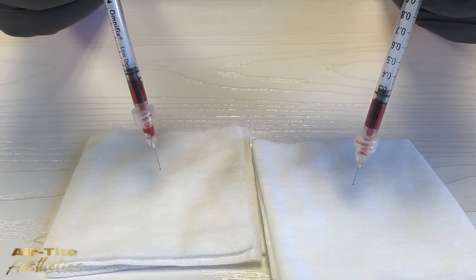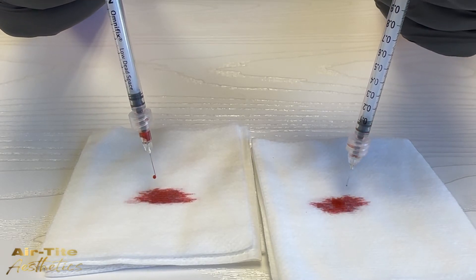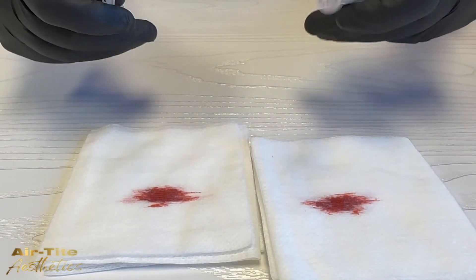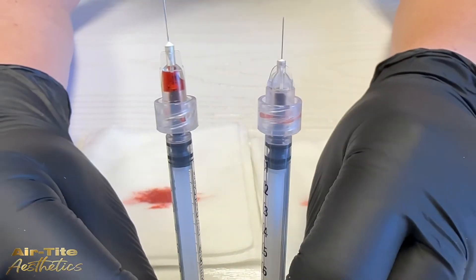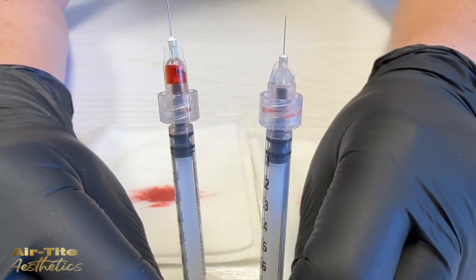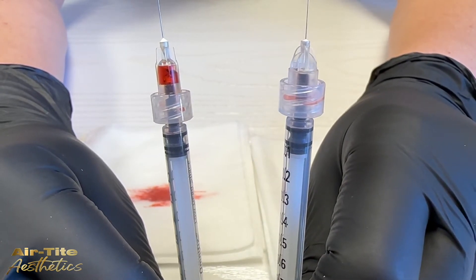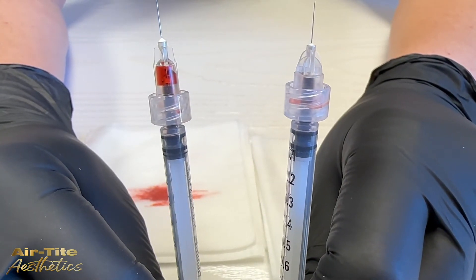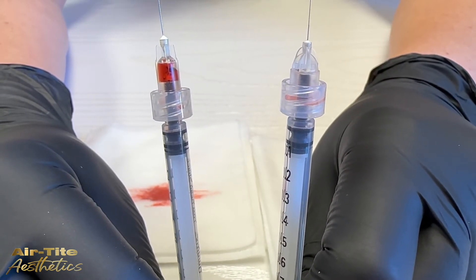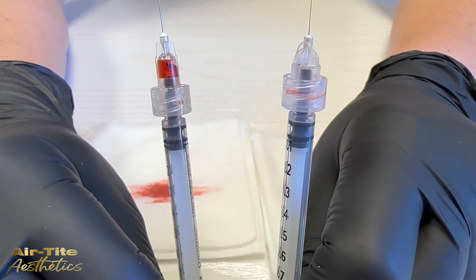Now we are injecting our fluid, trying to get all that product out. Once the plunger is completely engaged we can compare the amount of product left in the hub of both needles. You can see there's virtually no waste in the low dead space needle, and there's a measurable amount of product left in the standard needle hub. I've heard from several injectors this can equate to one to two units of toxin per syringe, which adds up really quickly.